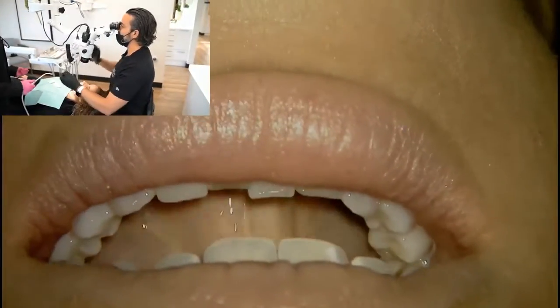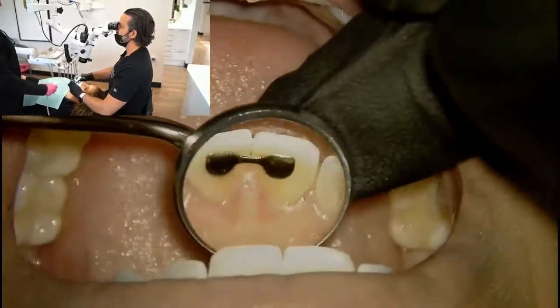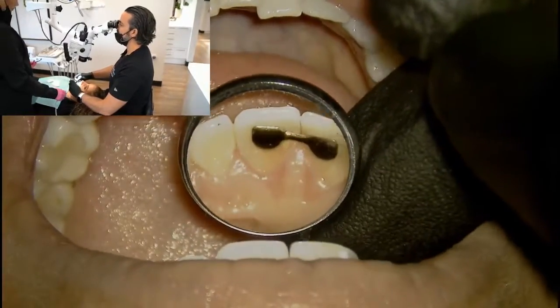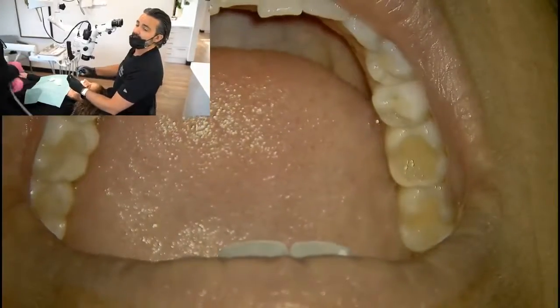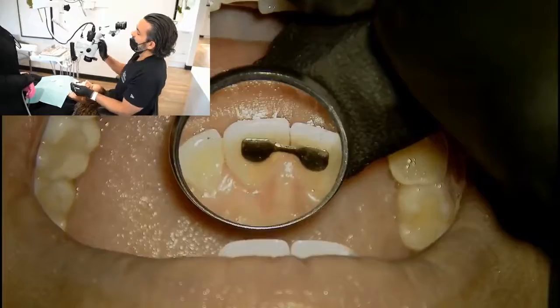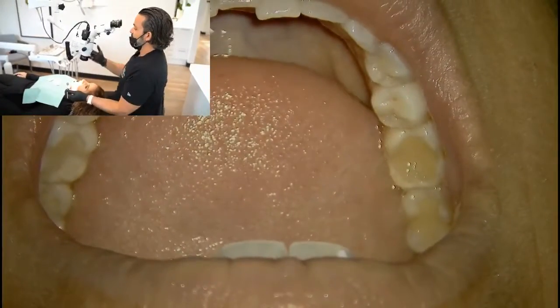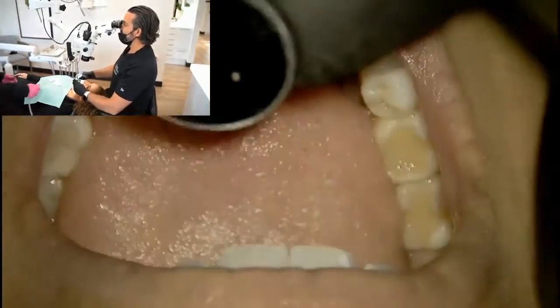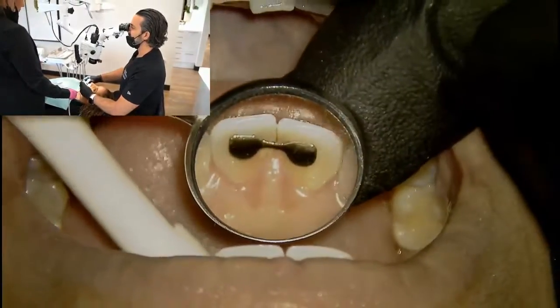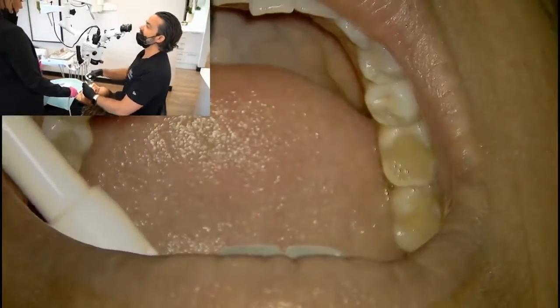The same student, Alex, also asked if you could go through the magnification steps again. I would also want to know your microscope's magnification steps. All right, so Alex, when it's a question of focusing, right now I'm at the lowest magnification setting.